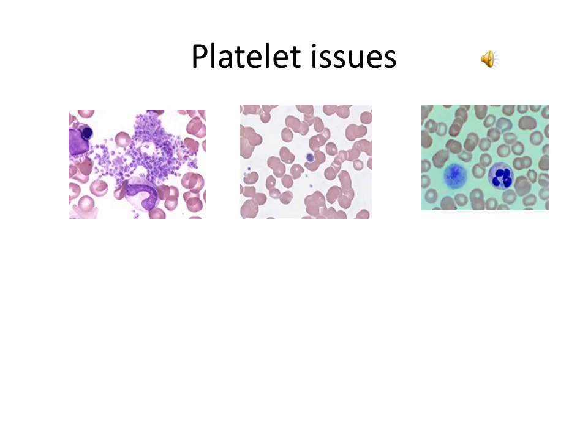Sometimes platelets will satellite around neutrophils. That too is due to EDTA. In the middle you have a large platelet, and on the right hand side, that big blue blob to the left of that segmented neutrophil is a giant platelet. Those all must be noted when you're doing a peripheral smear reading.